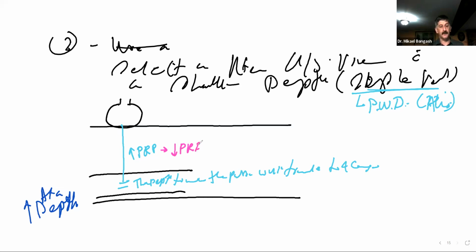You have a lesser PRF, right? And what is it that we already know that this lesser PRF is going to be doing? Practically, scanning wise, it has a lower Nyquist limit, which, you may recall, means there's going to be a greater likelihood of aliasing.